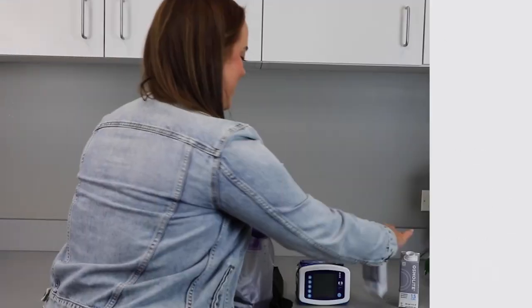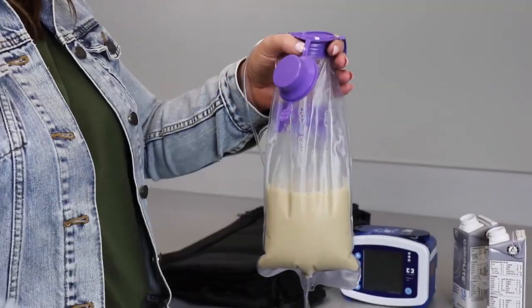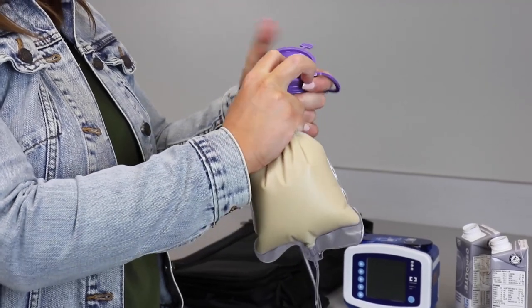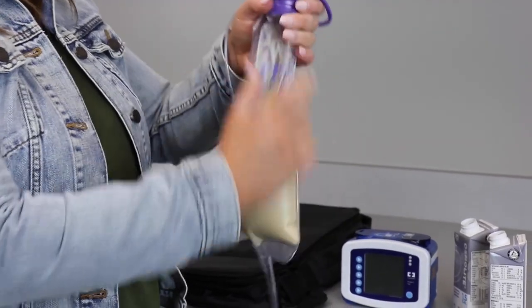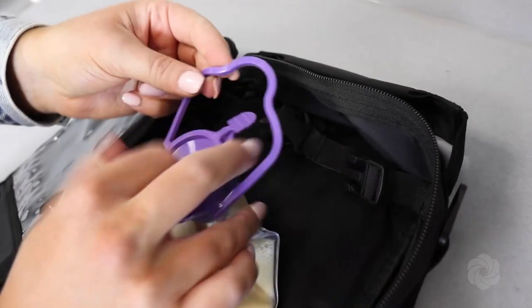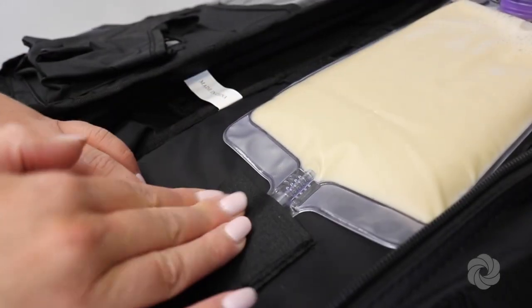Holding the feeding bag upright, pour in the formula. With your hands above the level of the formula, squeeze as much air out of the bag as possible, then securely close the lid. Place the feeding bag in the backpack by fastening the top handle to the backpack and securing the feeding bag with the strap.